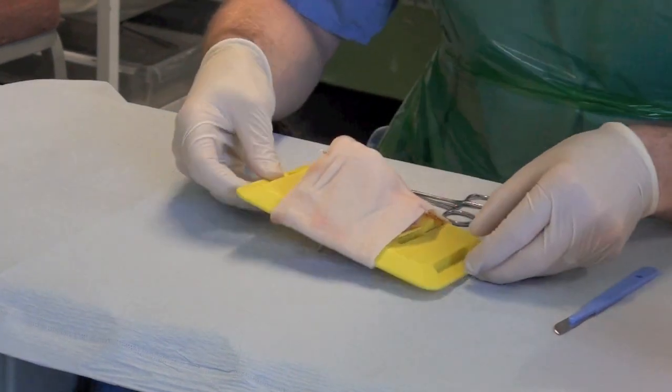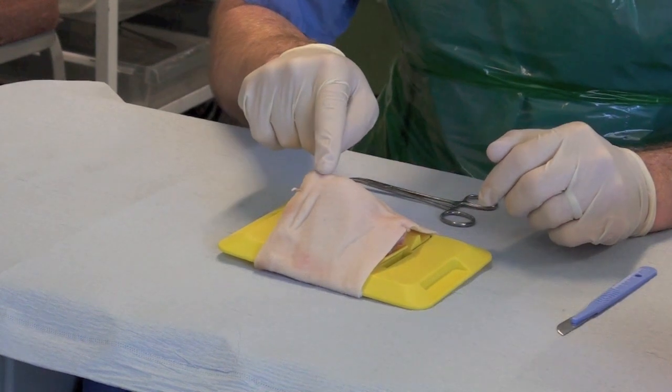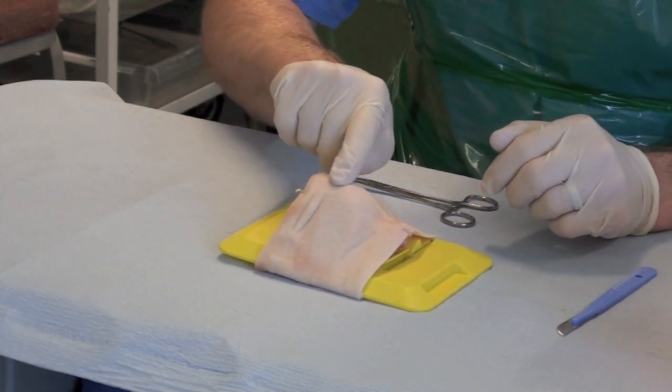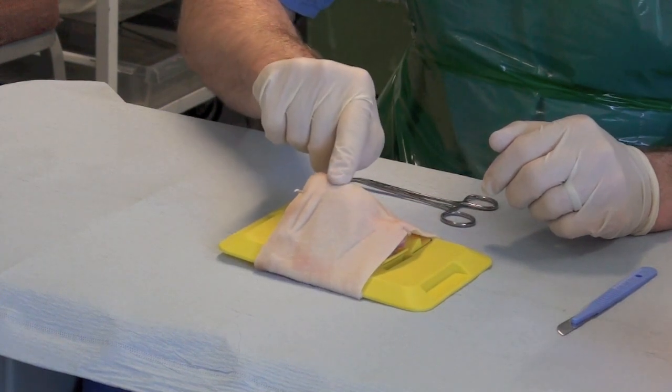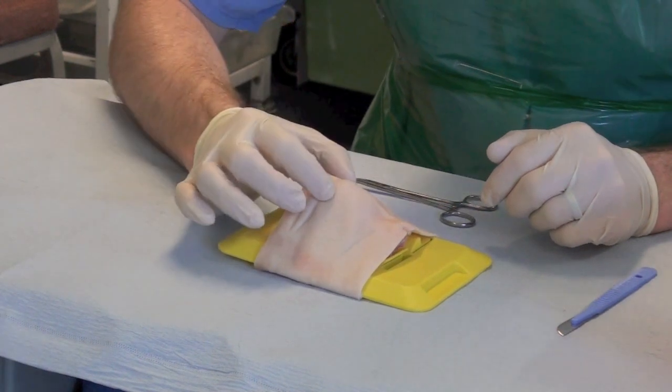So essentially what I'm going to do is first of all locate the cricothyroid membrane. Here I can feel the thyroid protuberance, so I'm going to work down and I can feel the cricoid cartilage just below that, and then in between there's a little notch where the cricothyroid membrane is. Then stabilise the skin.